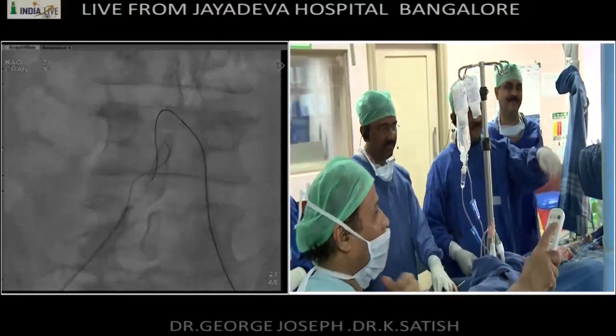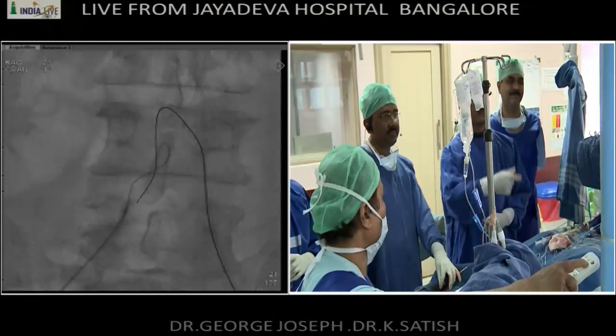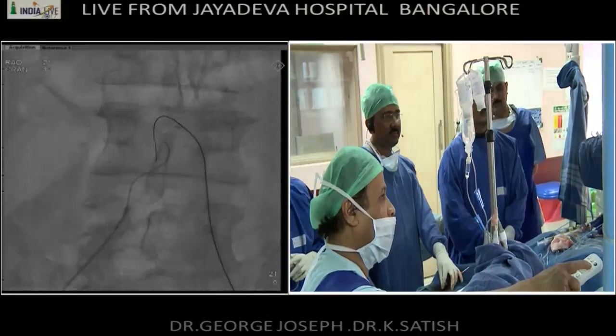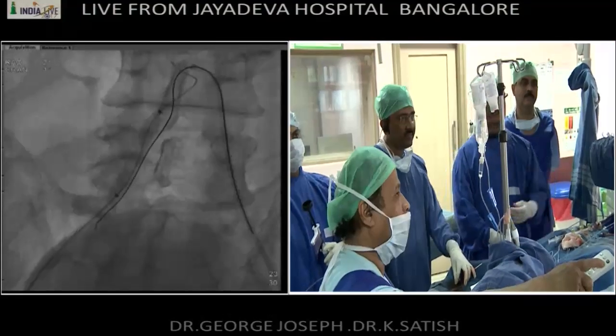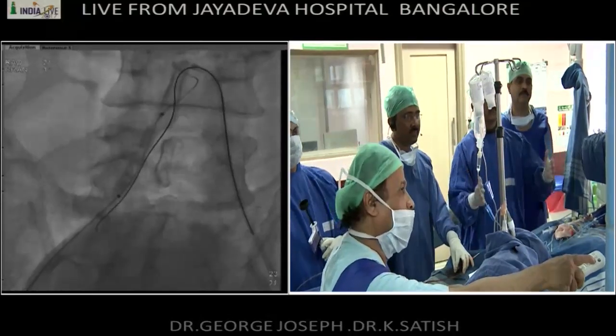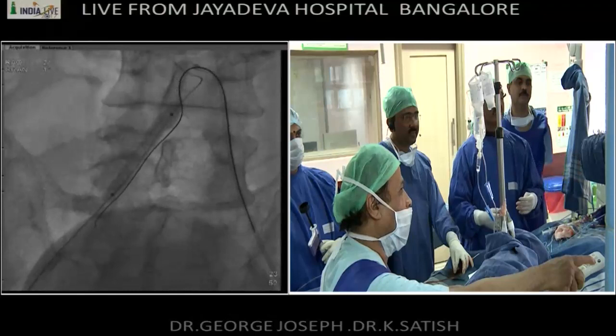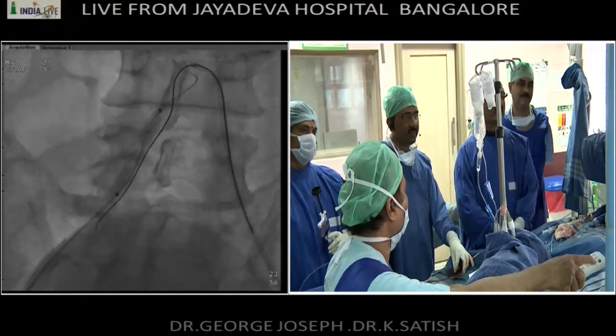So you can see the fluoroscopy of how we were tracking our way down through the CTO parallel to the other thing. But it went subintimal. So what we did is, from the retrograde wire, I ballooned the track I had made, something like the CART technique we use in coronary CTOs.